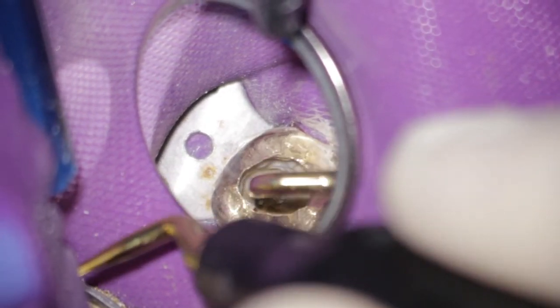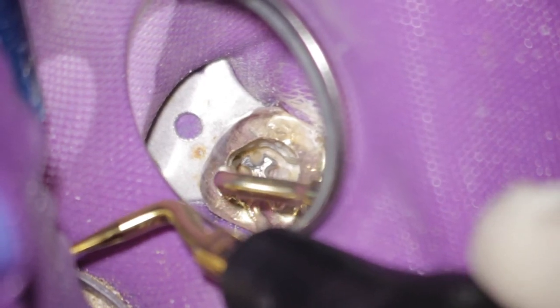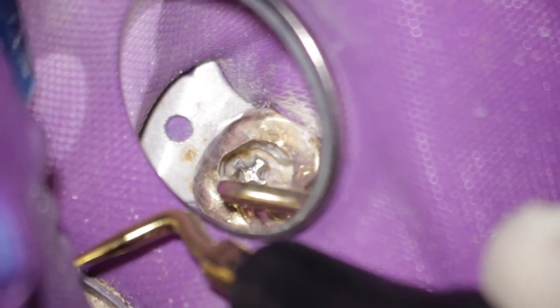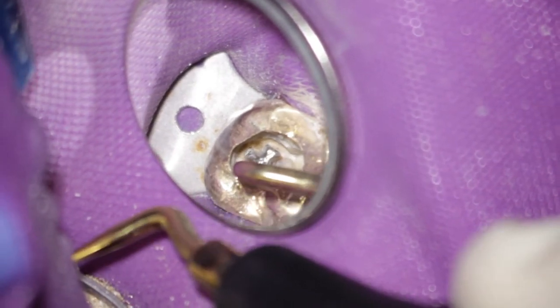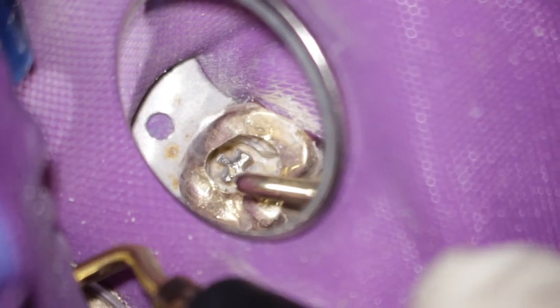The best way to cause a fracture is to use too much circular power with a handle and then try to screw it out. I cannot recommend this kind of technique in this case. There are others where this can be the right way to remove a post safely and fast, but not here.